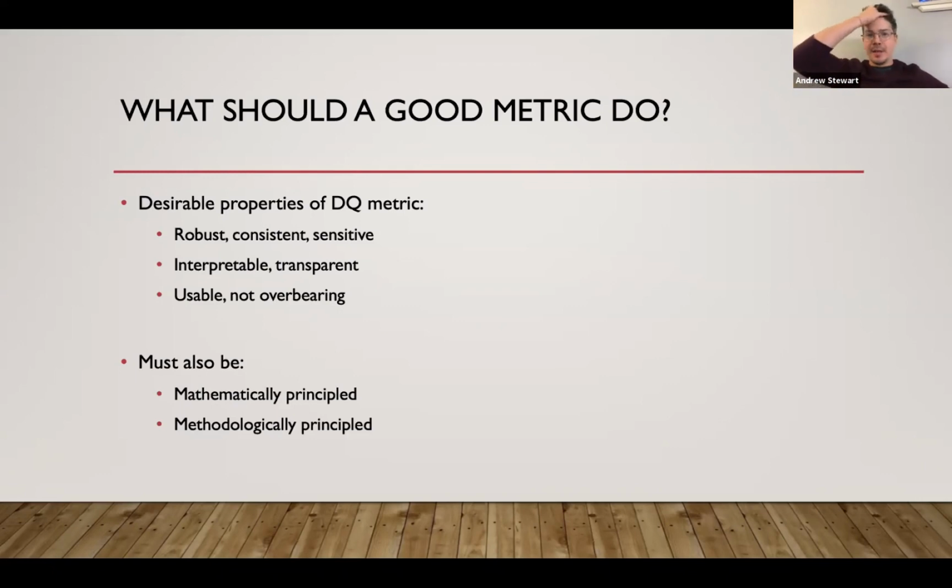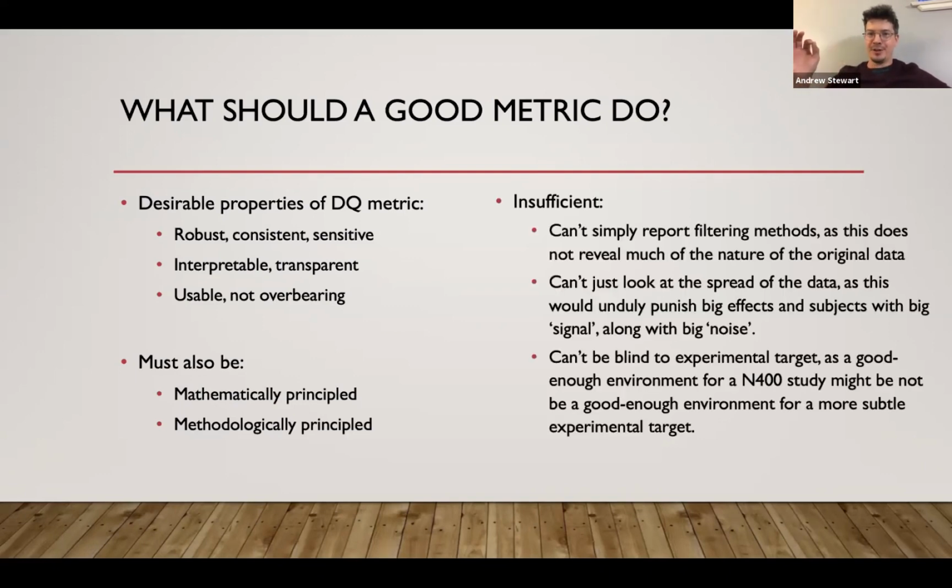I think it's the case that many people agree that such a thing is an issue, but they think in their lab they're addressing it already. Perhaps if you already describe your own methods, and you know that your practice has been going okay so far, it feels like an internal replication. But I would say for a new data quality metric, just reporting your methods is not going to be sufficient to give people a sense of what your data quality is.